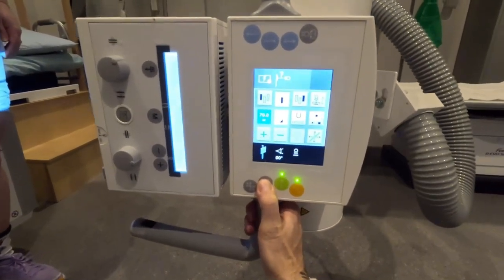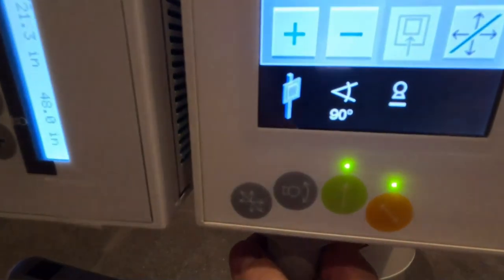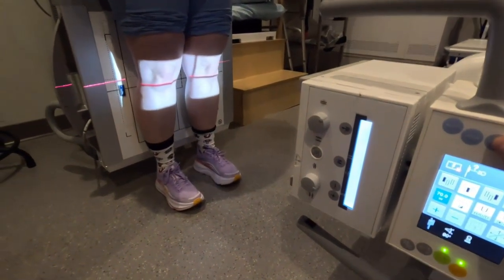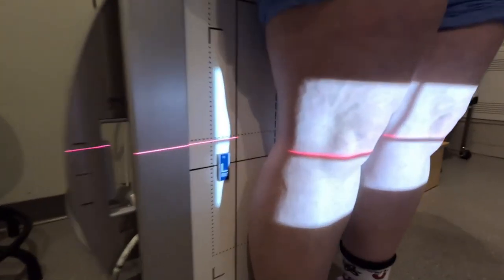Okay, so we're going to do a horizontal beam here for our AP, 90 degrees. Okay. Then when we lower this, you see, like if you had good positioning for your PA, use that dotted line as a reference. Okay, the difference in the angle is going to be the difference in your central ray right there.